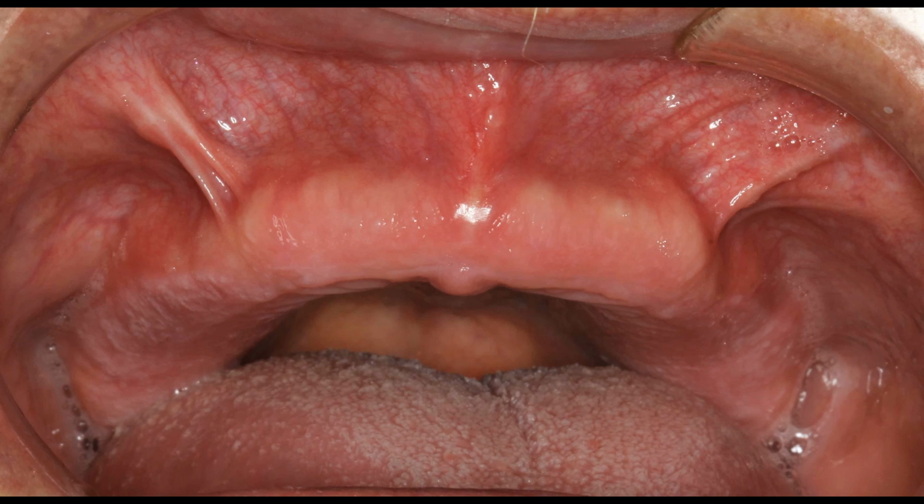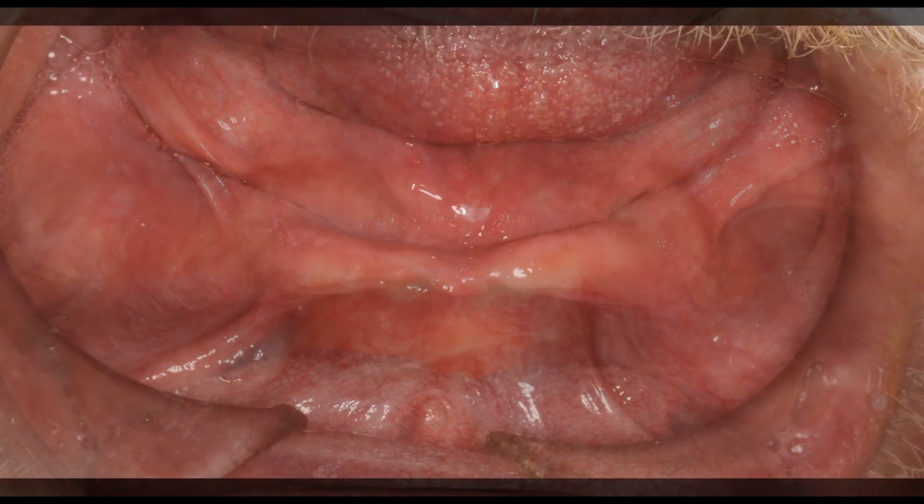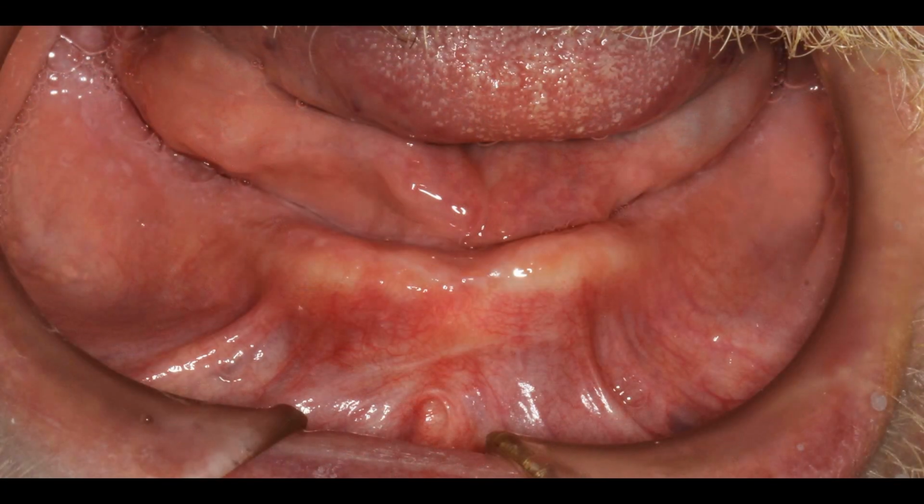This gentleman actually did not wear any dentures for many, many years and finally decided that it was time to fix his teeth. Or get some teeth, I guess I should say. But the good news here is he's got a very broad alveolar process, meaning the bone is very broad and thick, and the soft tissues are outstanding. His lower bone volume is less, but the soft tissue health is quite good.